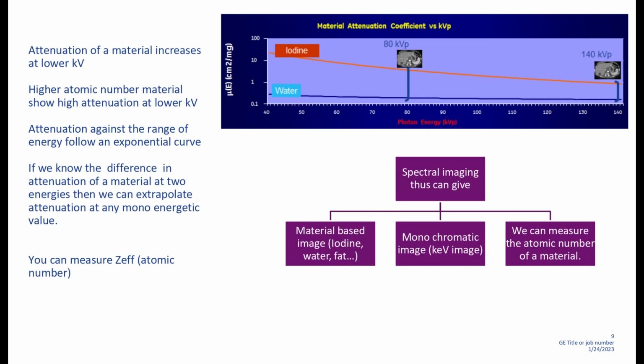Water now? Because we can just make a calcium image, for example, or just a water image for that matter. So will it help? See, if you want to suppress the bone, then we'll say iodine bone, iodine calcium, exactly, iodine HAP. We do that when you are looking at calcified plaques inside the blood vessel.